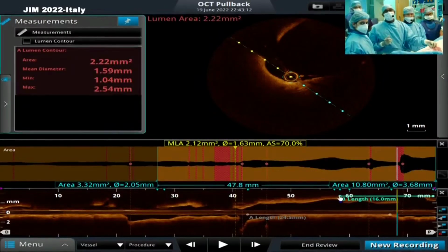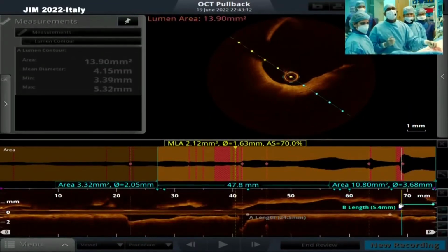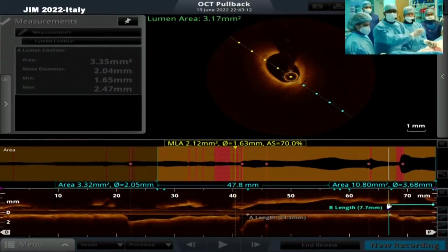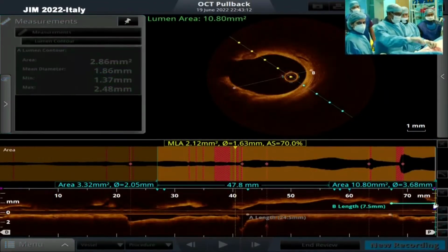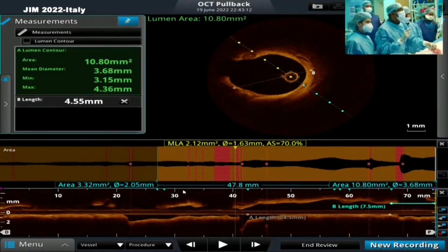Carlo, would you spare the left main? I think Dr. Di Mario would cover the left main, though. Yeah. Well, the discrepancy is very important, of course. You never like to go from 4.5 to a relatively smaller overlap.